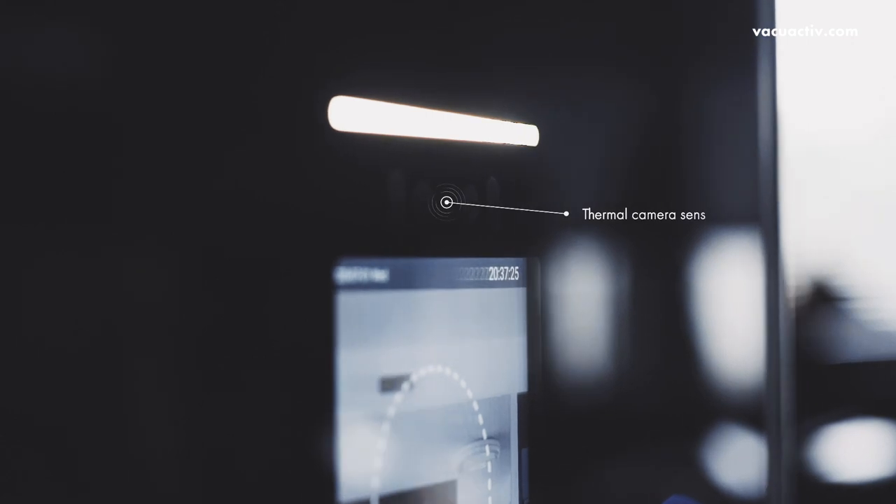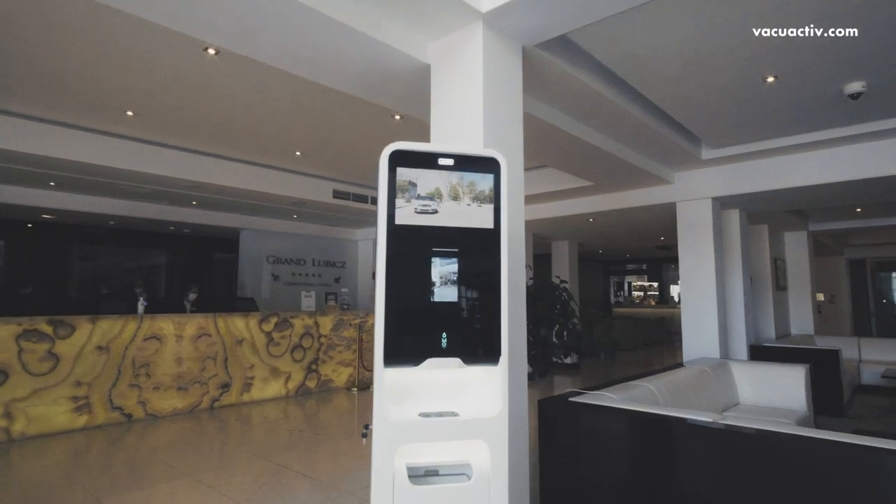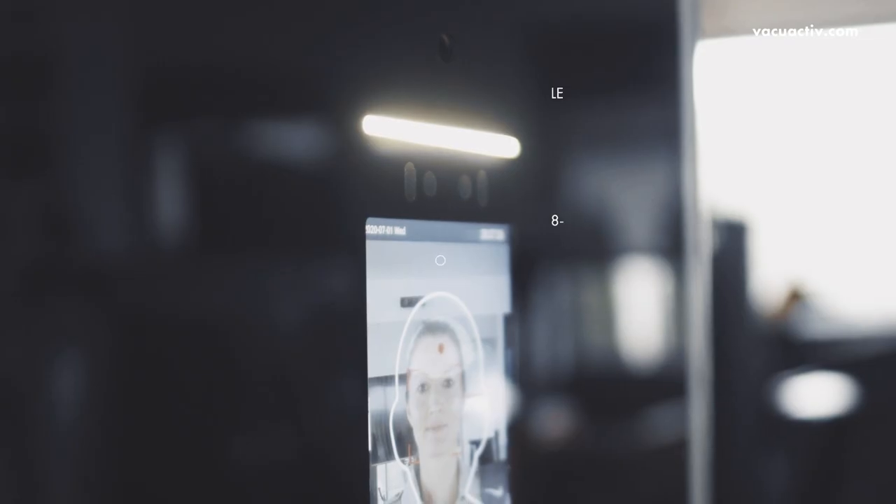High-precision thermal camera sensors can quickly measure body temperature and also check if a person is wearing a mask. On the 8-inch screen will be displayed a live view with the measured person.